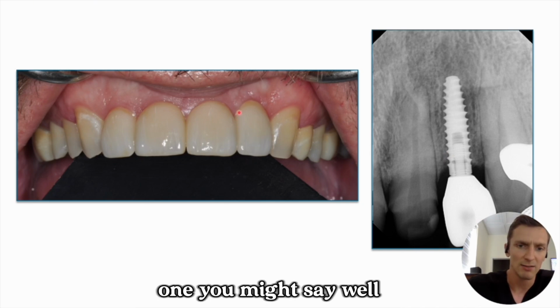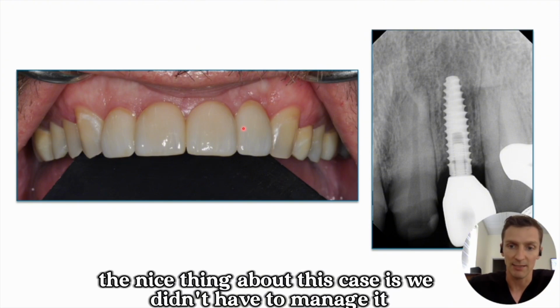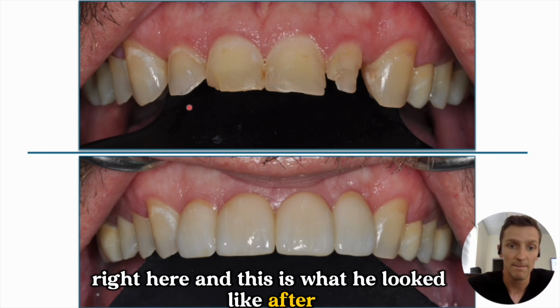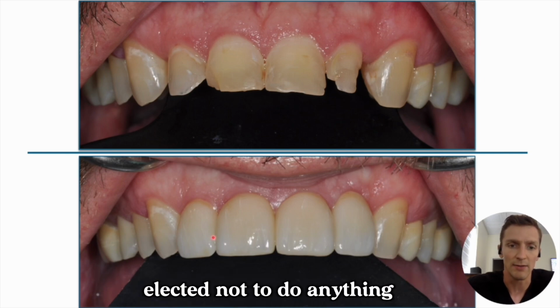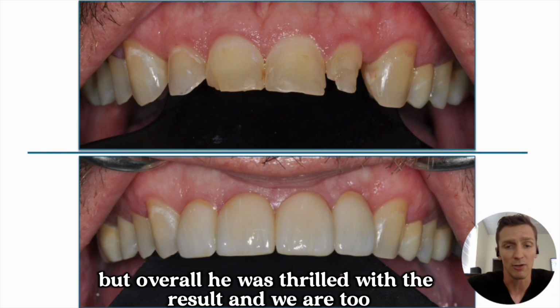Okay, now a couple things you'll notice about this implant and the crown. One, you might say, well, that gum level looks a little high. I agree with you. The nice thing about this case is we didn't have to manage it. I'll show you that in a second. So in the end, this is what our patient looked like before, right here, and this is what he looked like after. And you can see we really built up these teeth. We improved the color. He did some whitening on the back teeth. Elected not to do anything to mask some of the discoloration on the back teeth. But overall, he was thrilled with the result, and we are too.